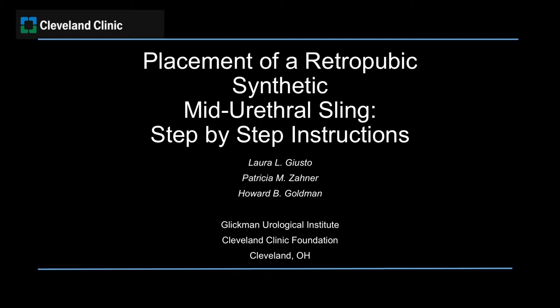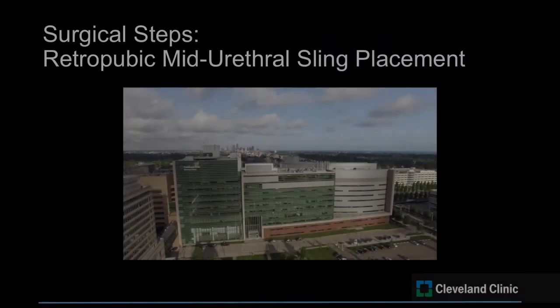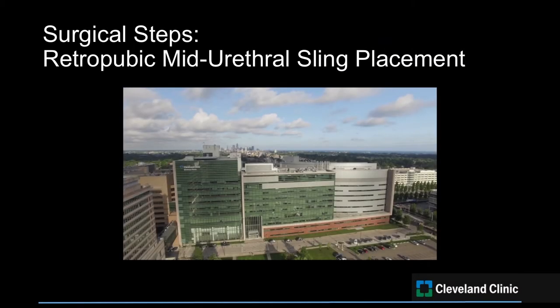Mid-urethral slings are the most commonly utilized option in contemporary surgical management of stress urinary incontinence. We present a step-by-step instructional video for placement of a retropubic synthetic mid-urethral sling, highlighting the steps taken to perform a bottom-up transvaginal retropubic mid-urethral sling. We will describe the use of the original tension-free vaginal tape upon which much of the literature on mid-urethral slings is based.